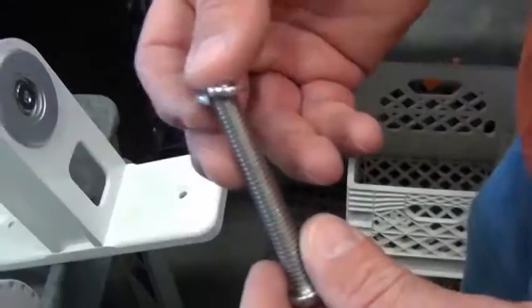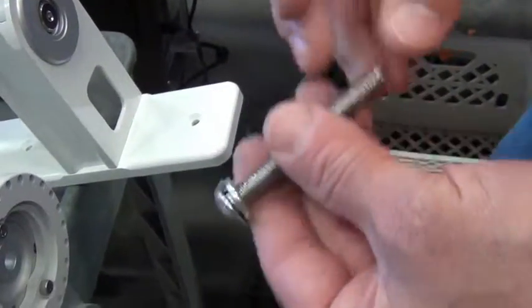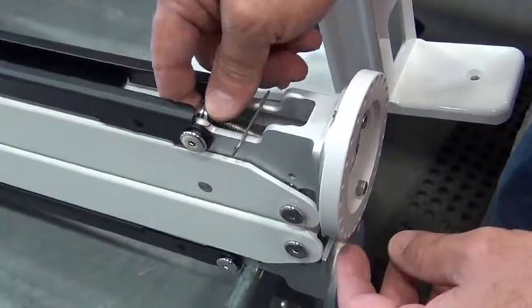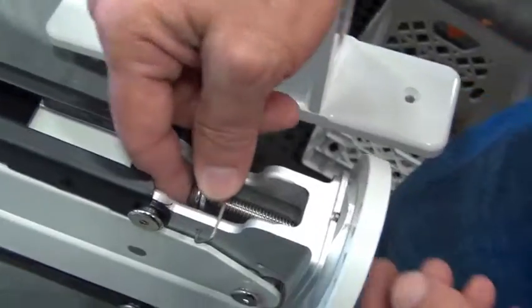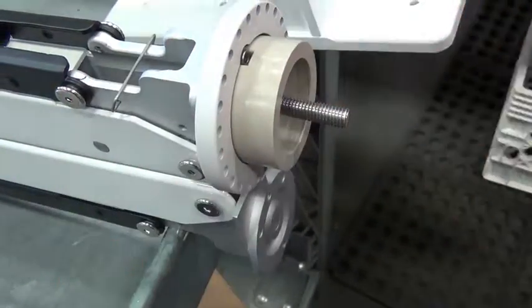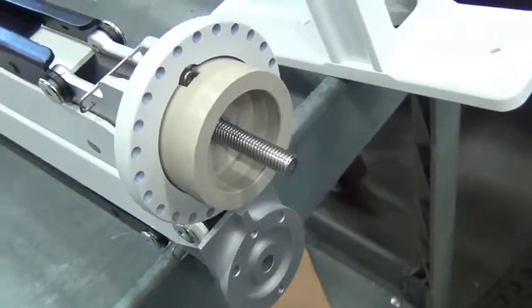The rotation stop is then attached to the arm. A 3/8-16 by 2 3/4 inch bolt with a 3/8 washer slides into the end frame. A brake sleeve slides over the bolt. The grooves of the sleeve align with the screw heads.